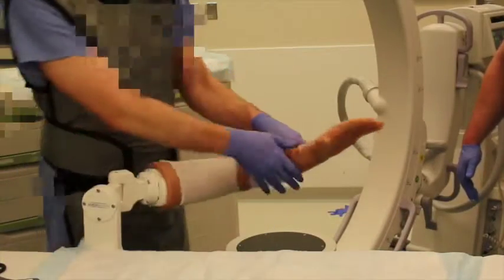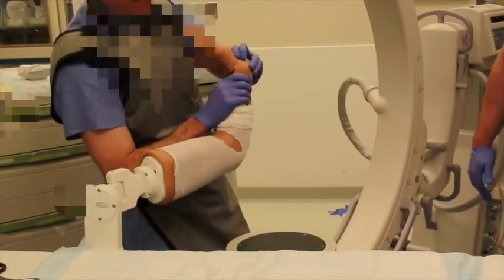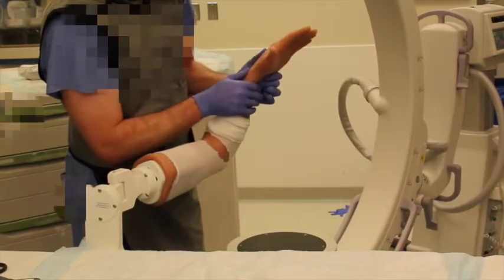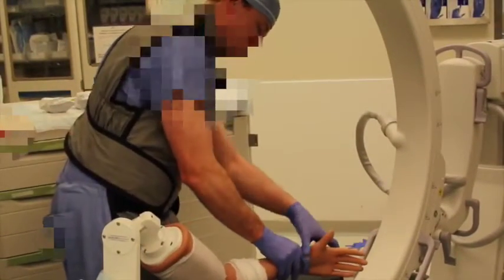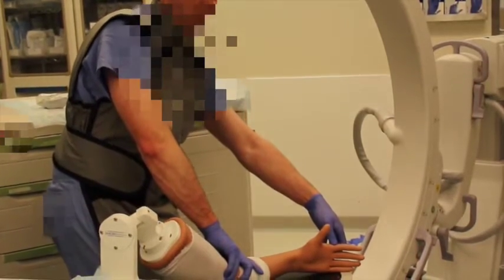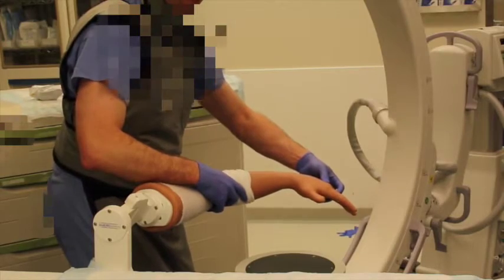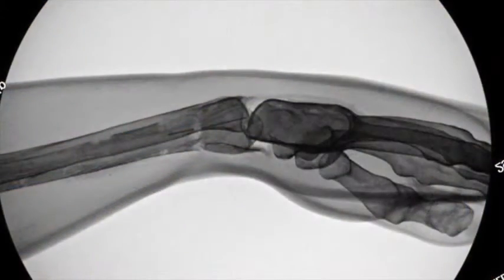At the start of the simulation, in order to reduce the fracture, the angulation must be over-accentuated and the deformity must be recreated. At this point, distal translation on the fracture can affect an adequate reduction. This can be confirmed with fluoroscopic imaging, noting the near anatomic position of the fracture.